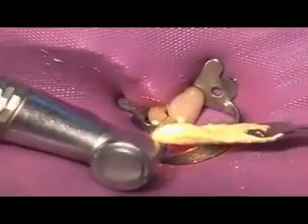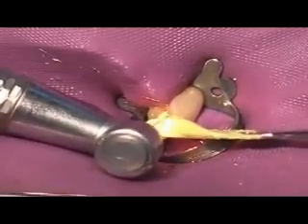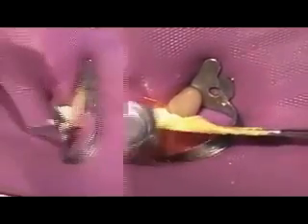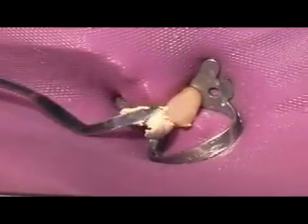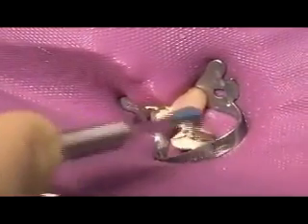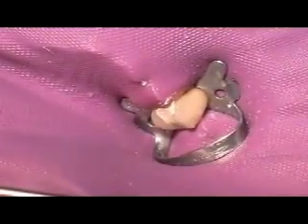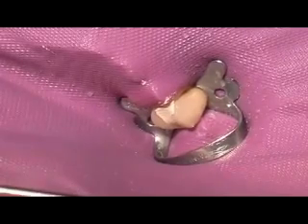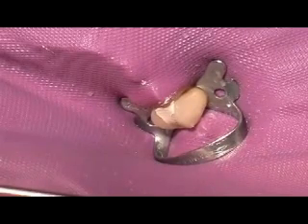In such cases, a medication, the yellow paste seen here, is rotated into the tooth, which is then tightly sealed for a couple of days. However, the temporary sealing material must be absolutely saliva-proof. That's the gray compound seen in the image, as it keeps the tooth tight for about 1 week. Another session must take place no longer than a week after the initial session. Otherwise, bacteria from the saliva would enter the interior of the tooth, and the entire previous procedure would have to be repeated.